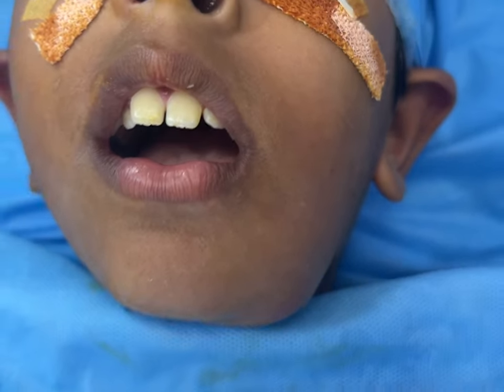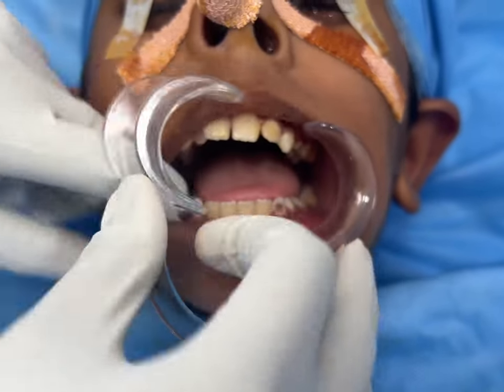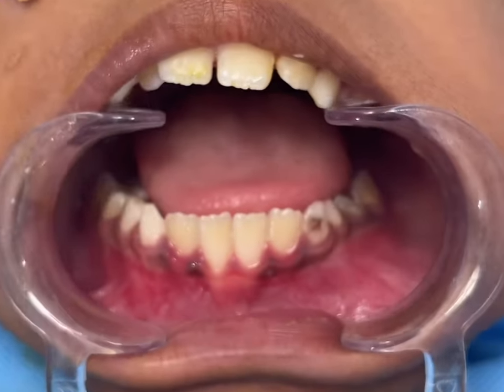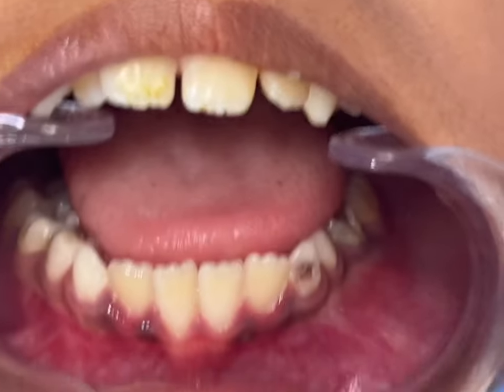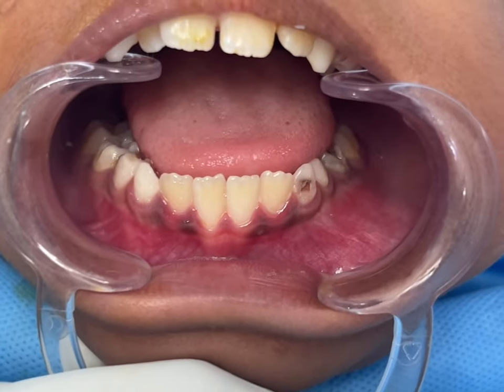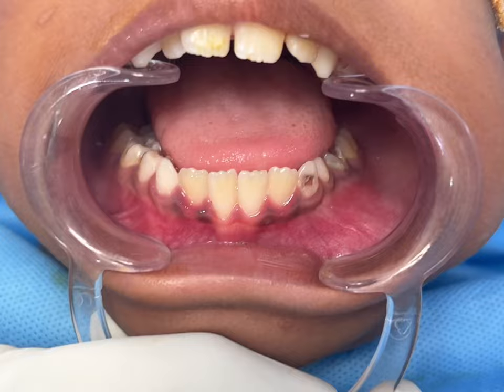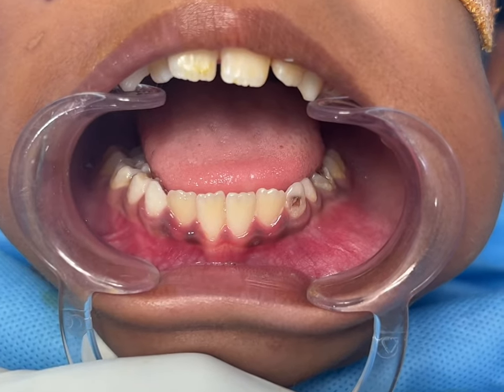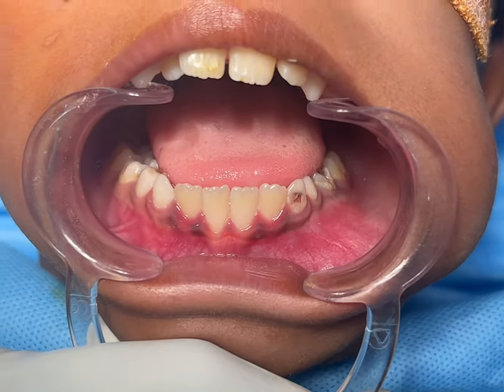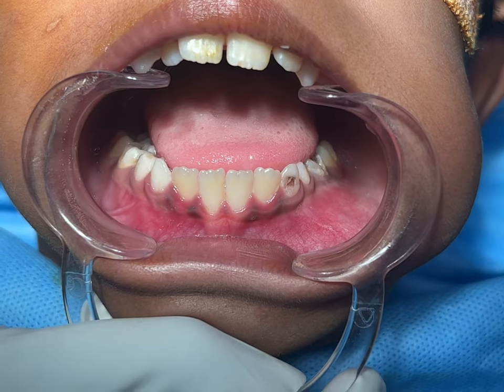We're going to be removing this from inside the mouth. With the cheek retractor you can see the swelling inside as well, in the vestibule or inner aspect of the lower jaw. We'll be removing a few teeth, including one permanent tooth, and then performing a cyst enucleation and primary closure.